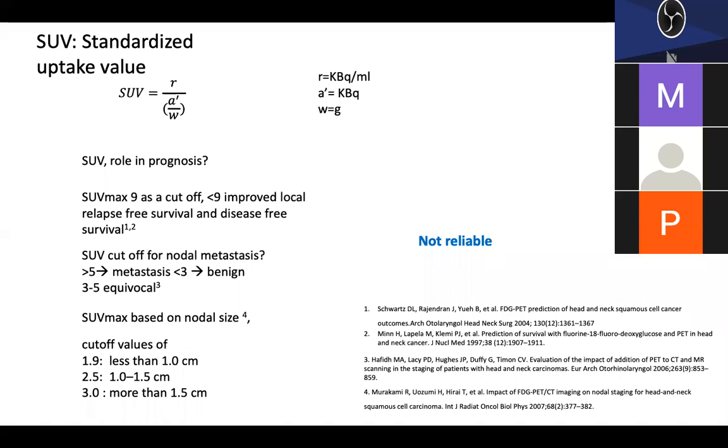Yeah. So Dr. Sayak, one more question, since there are not many questions posted. I would like to ask, how do you calculate the size of the lesion based on PET-CT images? Because of the peritumoral inflammation and edema, there is always a chance of overstating the size. Yes, that chance is always there.